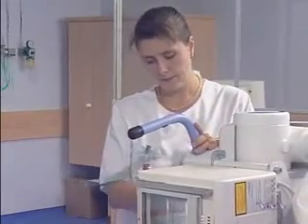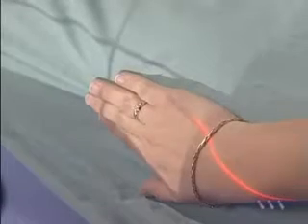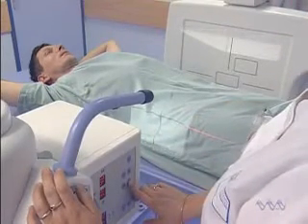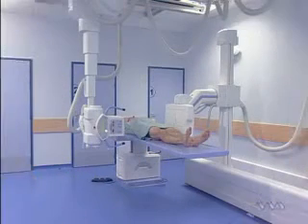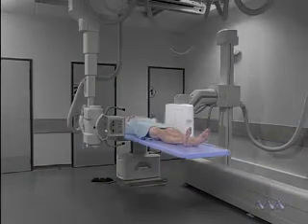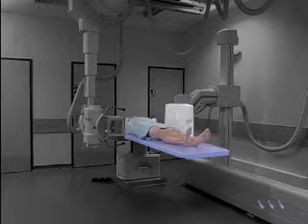At the end of the automatic positioning, the user, as previously described, can refine the beam alignment using the laser localizer and correct the dimension of the irradiated area to suit the specific examination. The detector can be placed as close as possible to the patient thanks to the reasonable width of the patient tabletop. If the width were too great, it could be necessary to laterally slide the patient on the tabletop, a very uncomfortable situation both for the user and the patient.